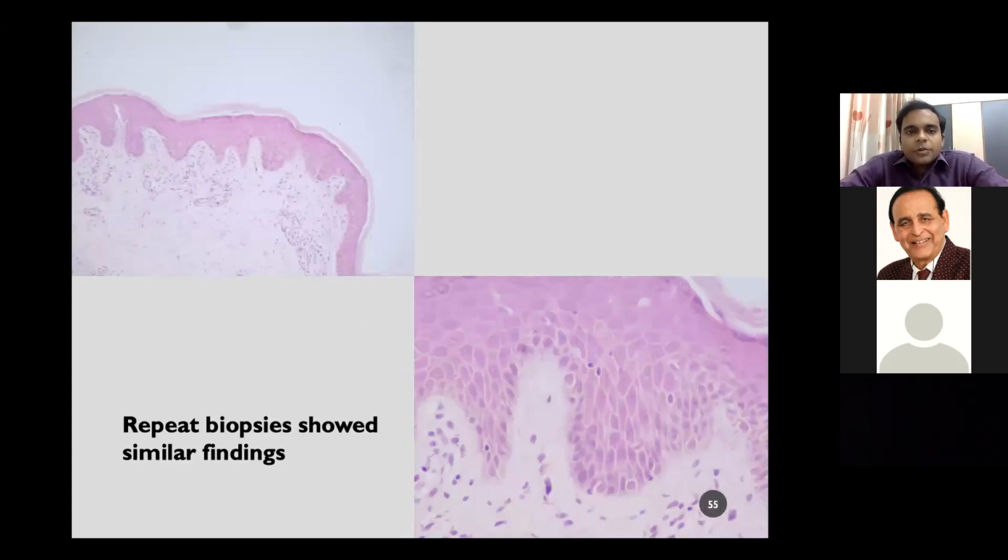So clinically, you can see she has slight hyperpigmentation, some increased skin markings, okay, and very fine scaling, which is not even apparent in these images because they are at a distance and small size. So when you look at histopathology, I will give you the clue here. If you see spongiosis, again it is non-specific.